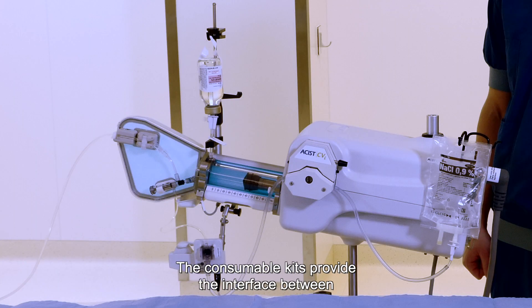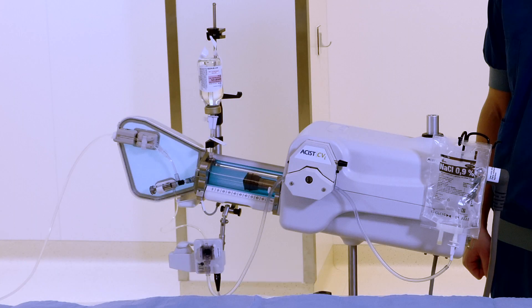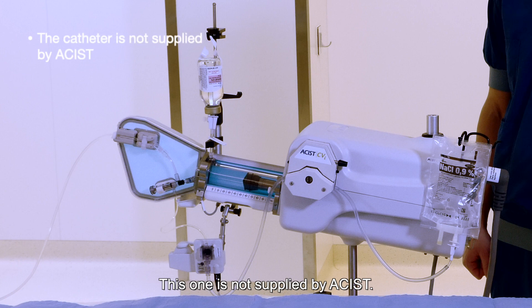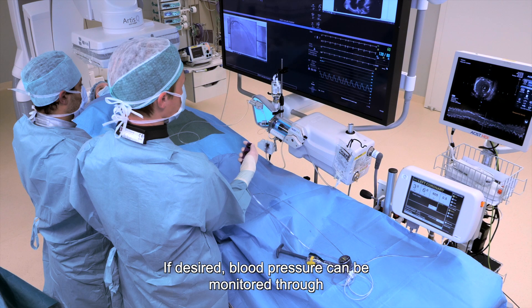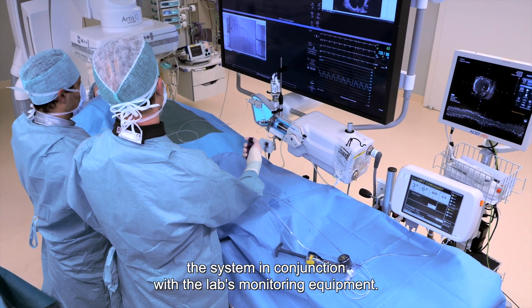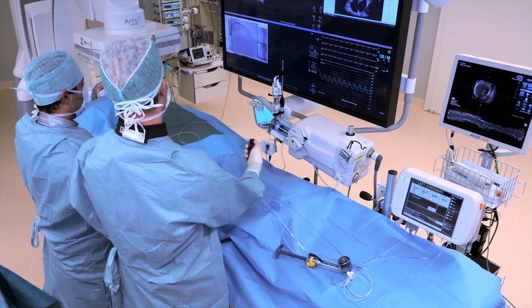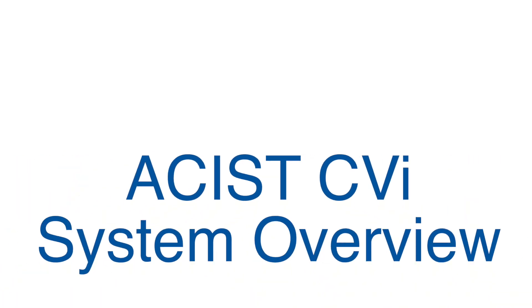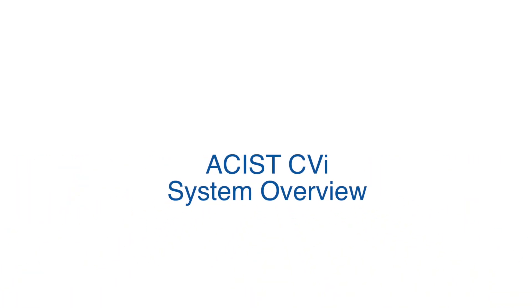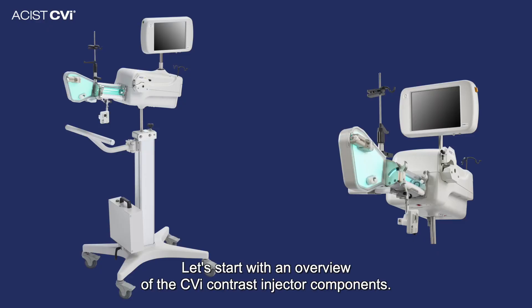The consumable kits provide the interface between the CVI system and an angiographic catheter, which is not supplied by Assist. If desired, blood pressure can be monitored through the system in conjunction with the lab's monitoring equipment.